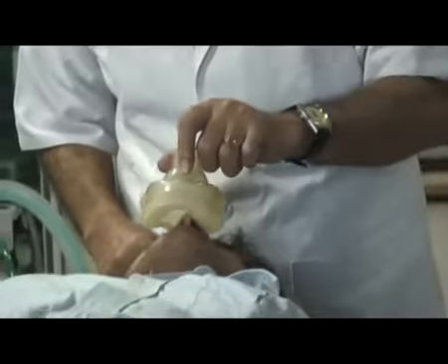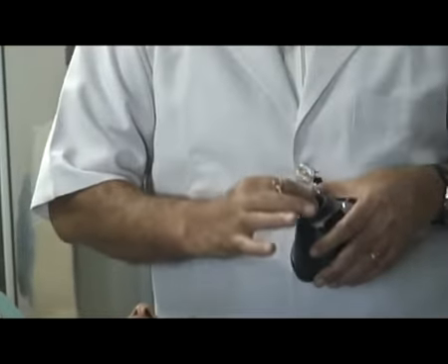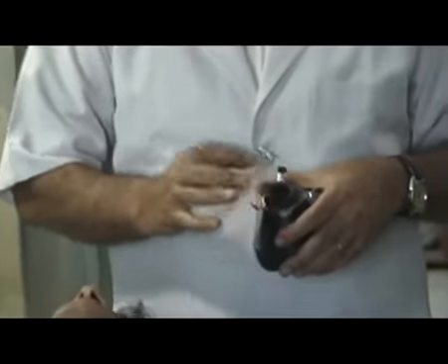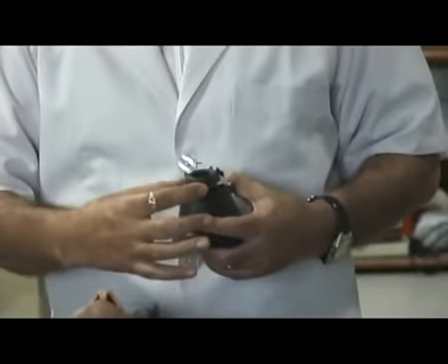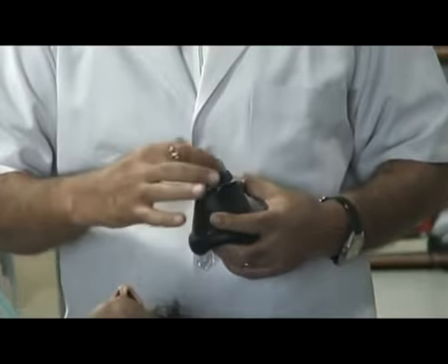The second part is the seal, which fits on the patient's face. The third part is the connector, which is made up of a thickened part with an internal diameter of 22 millimeters. A ring with horns is placed around this connector, and a mask strap can be attached to it.